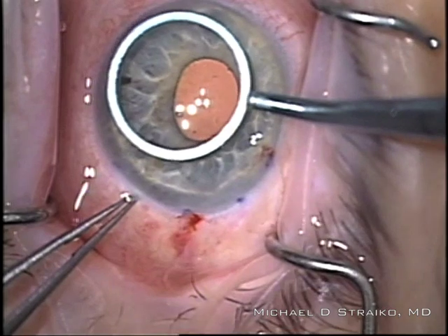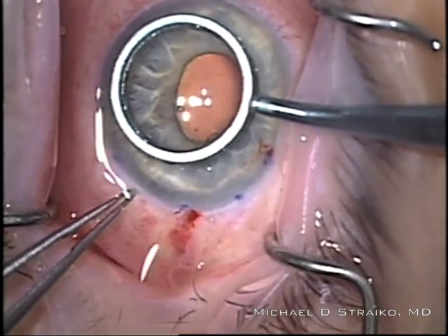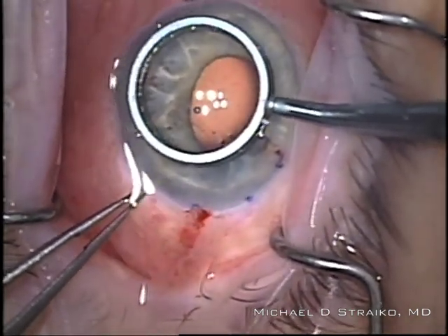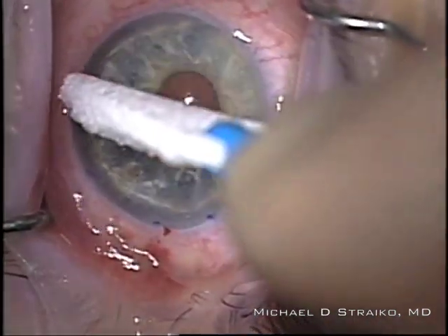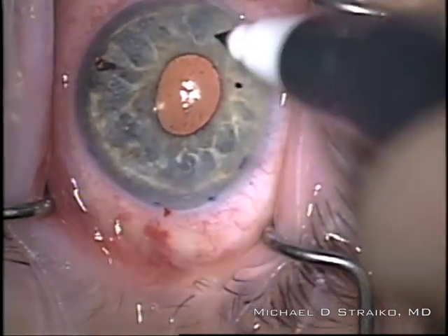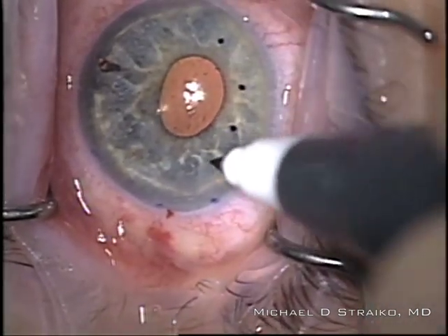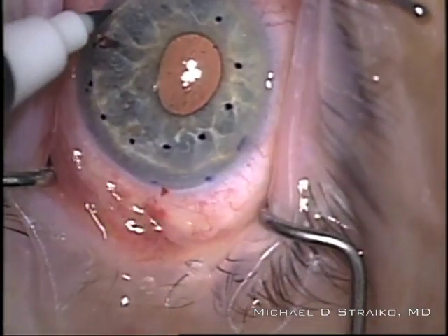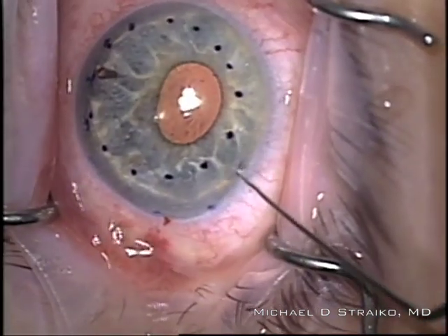I put in a little more cohesive viscoelastic. This is an 8-millimeter marking template that I'm making a small impression in the cornea with. I'll dry off the surface so I can identify that impression and then mark it with ink so it's easier to find. This will serve as a template for where I'm going to remove the patient's Descemet membrane and for where I'll line up the graft later on.